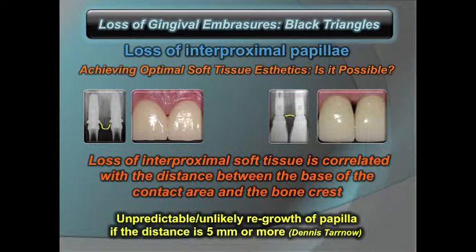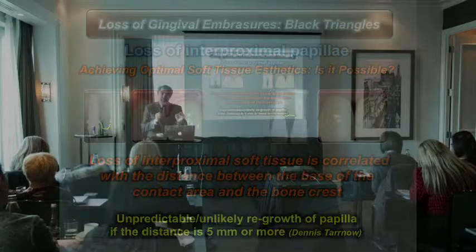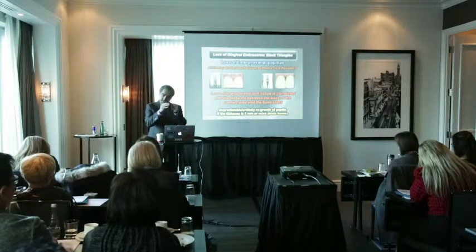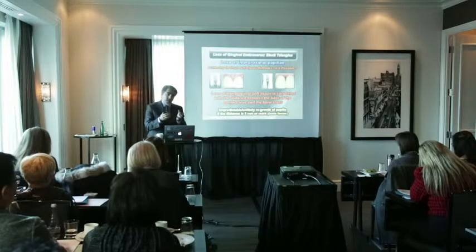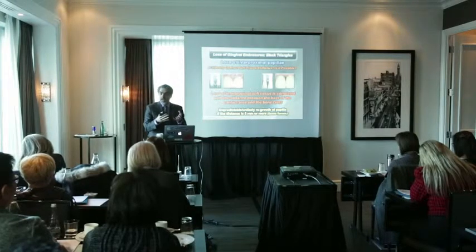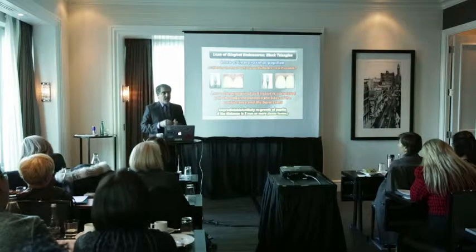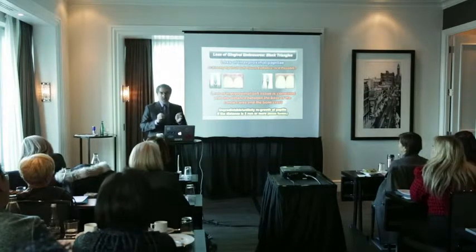And what are you getting from this connection? What are the benefits of having this biological connection? The benefit is that everything is sealed. But the catch is that it has to be convex. It cannot be a concave type of connection, a concave type of surface. You have to make sure that you have this ovate pontic, not a saddle, not a concave connection. Otherwise, you're going to have a lot of problems. But as long as it's ovate, it's going to be working very nicely.